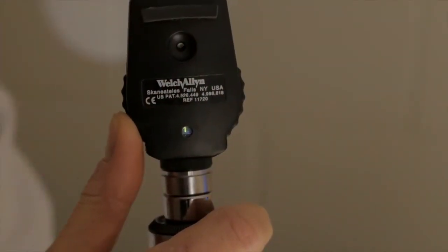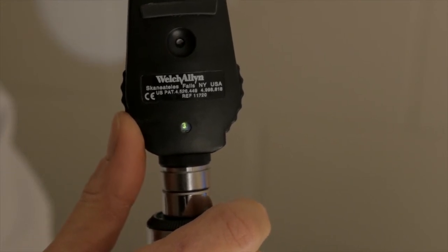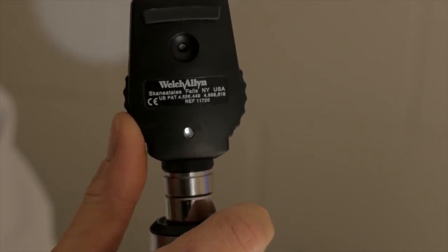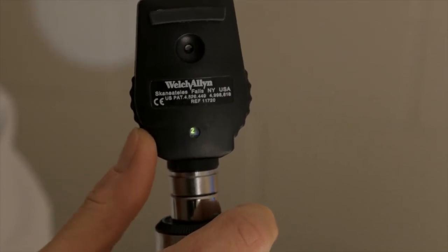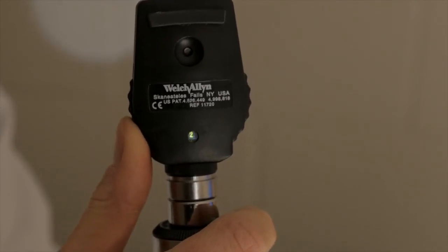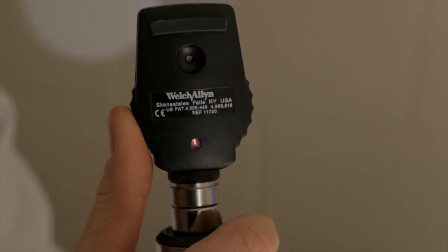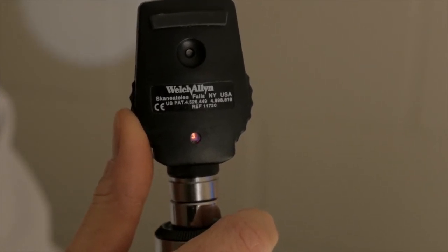The numbers visible on the rotating dial of the ophthalmoscope indicate the strength of the lens that is in place, expressed in diopters. Most animals' fundi are in focus at 0 or -2 diopters. The plus lenses, represented by black or green numbers, will converge light, bringing lesions elevated from the surface into focus. The negative lenses, represented by red numbers, will diverge the light and bring lesions depressed from the surface into focus.